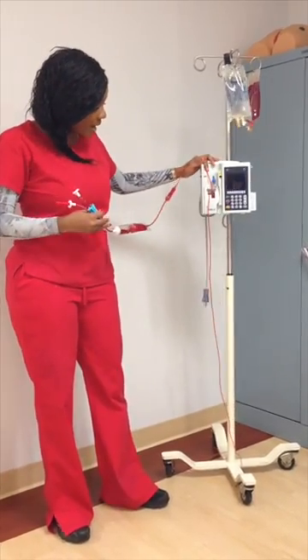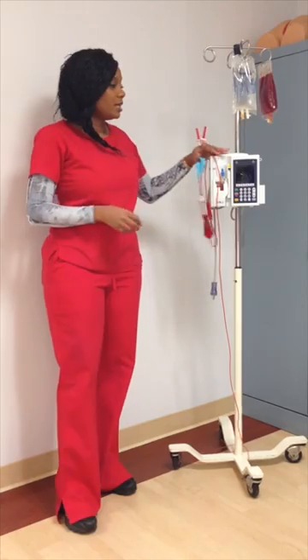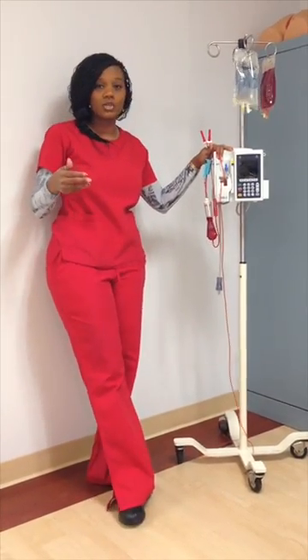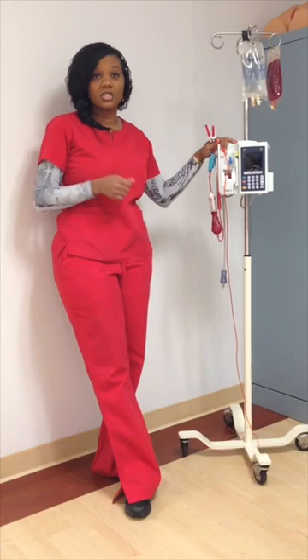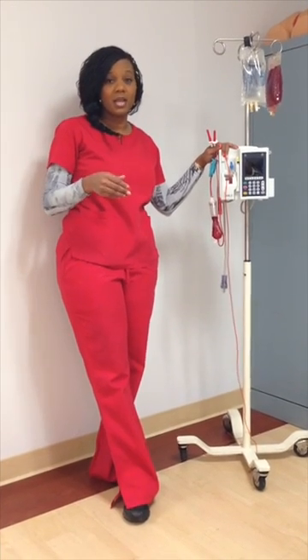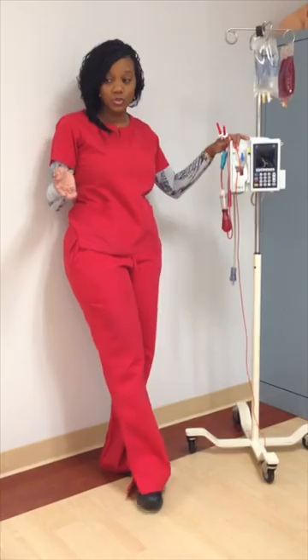I have already primed my tubing. The basic things you need prior to starting your blood transfusion are: one, a physician's order to have it done, and two, the patient has to sign consent to have the transfusion take place.